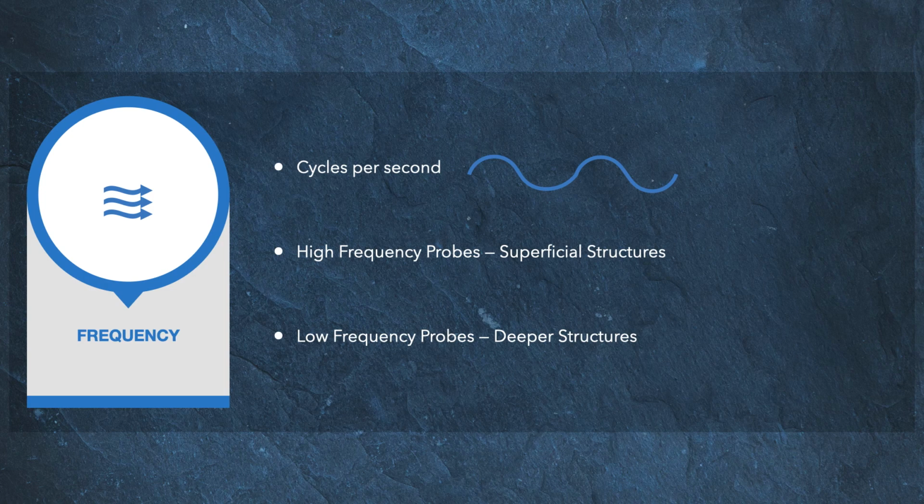Lower frequency probes or settings are typically used for those which are deeper in the thoracic or abdominal cavities. With these, you will note that they may sacrifice some level of detail, and you will often see these being used for echocardiogram, most abdominal imaging.